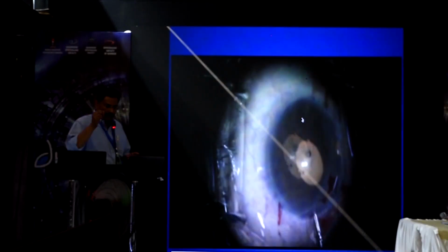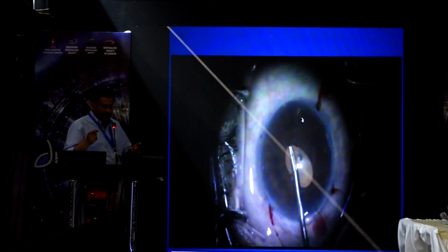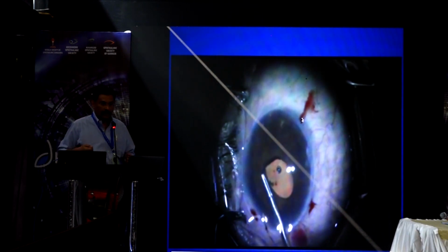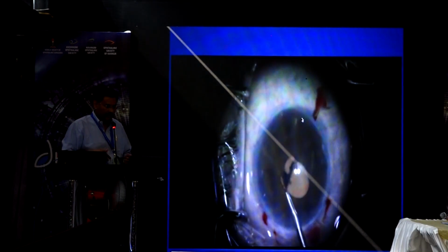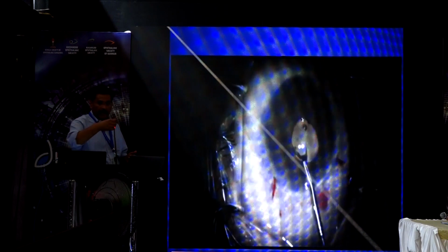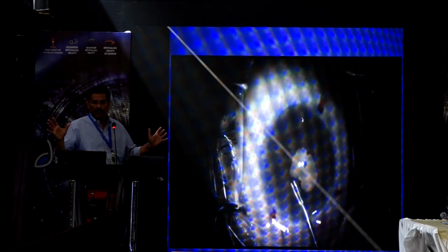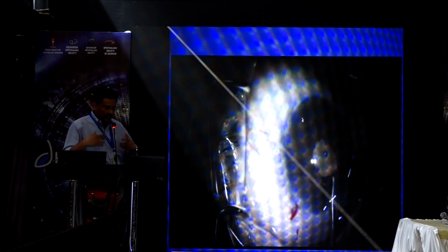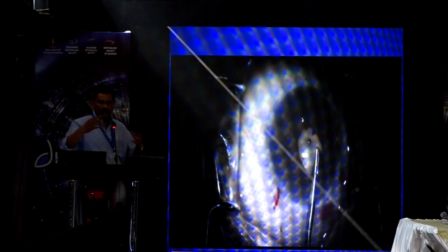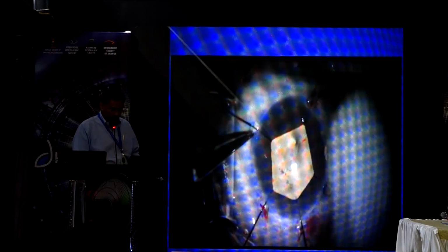Don't cut the sphincter, but if you make a small nick there, it will be easy to drag it along. Don't pull it drastically towards you, because it can cause a root iridodialysis from the iris root. So, not radially, tangentially pull and try to tease this out. Once these membranes are gone, the pupil becomes much looser and freer. Then it is more amenable to stretch or even hooking. Otherwise, it will tear more and look very bad post-operatively.